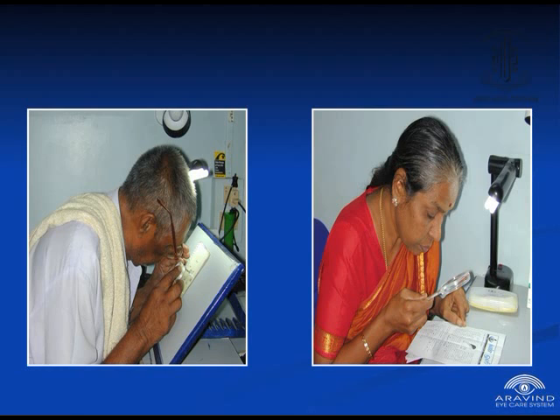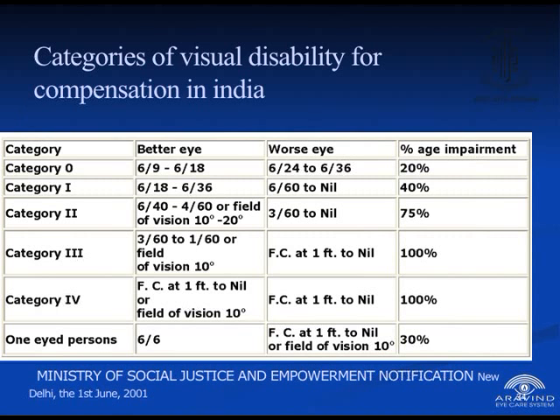So ultimately it's going to be a combination of optical and non-optical devices. The patient here has spectacle magnification. He also has a handheld magnifier. He has good illumination. Here this patient is using just a handheld magnifier and good illumination.